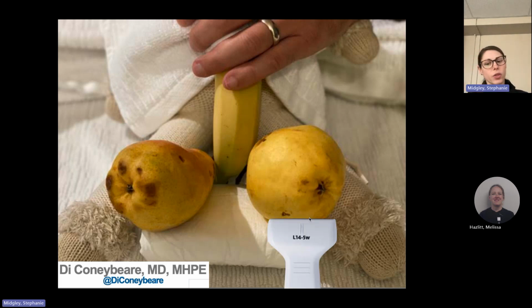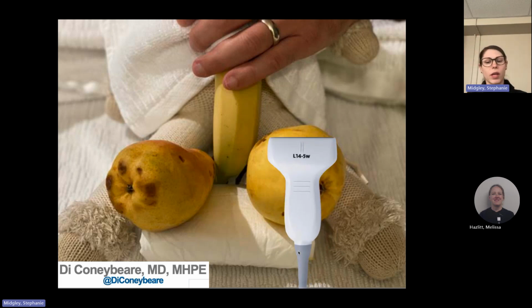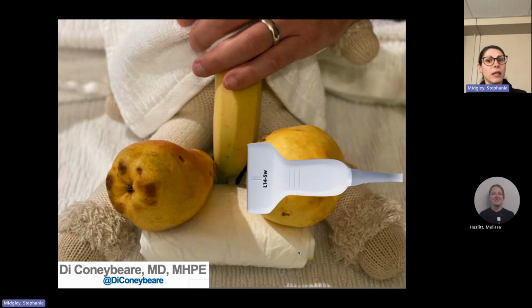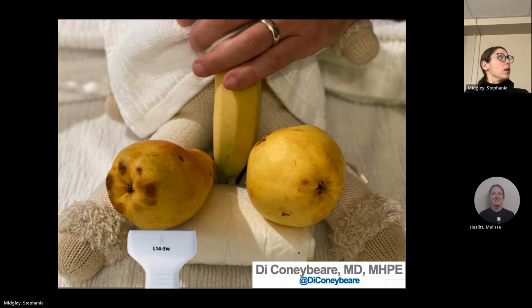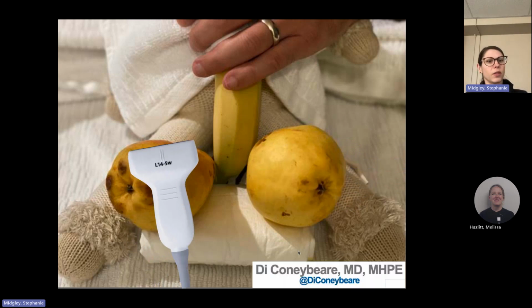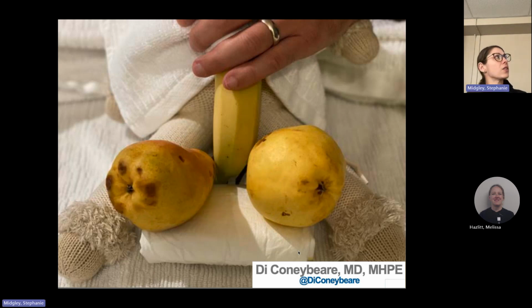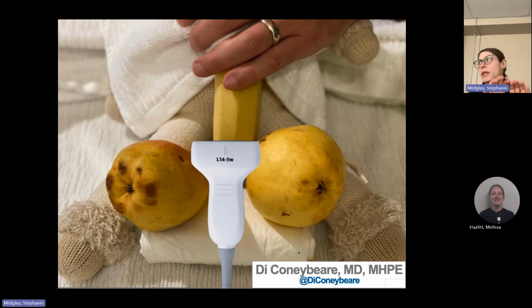And so you're going to start with one and scan up and down. So in your transverse, you're going to rotate and then scan across in long axis. You can do that on both sides, left and right, so you can compare. And then your last view is what we call the buddy view. This is where you're scanning in transverse across both testicles to get a side-by-side comparison of the two.